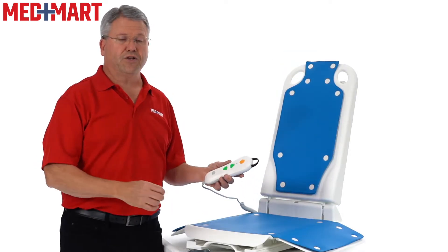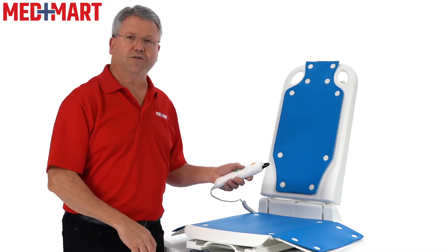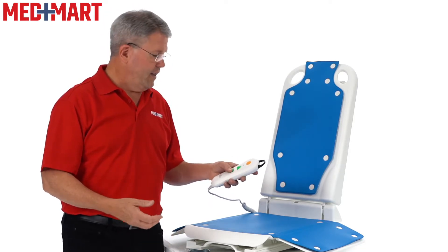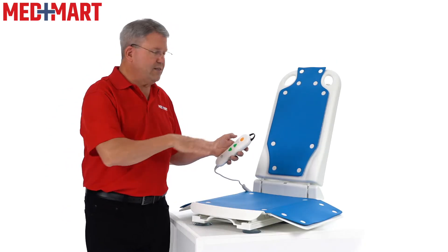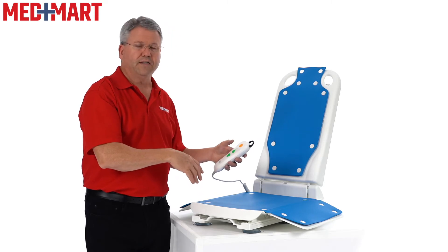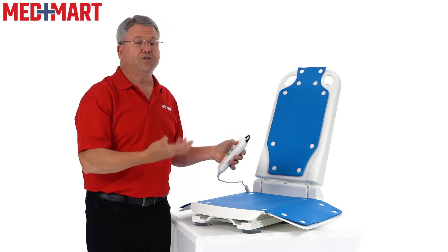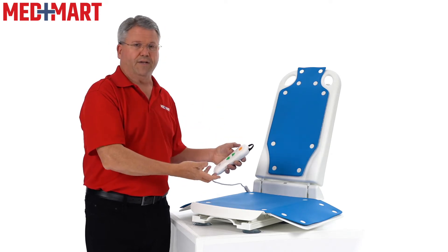The easy to use hand control features up and down buttons and has a little texture to it so that if you have any sort of visual impairment, it's really easy to use. It also features an emergency stop. If the lift stops and doesn't go in the off position as you're lowering it down, there is an emergency stop button. If you hit that, you have to raise it all the way back up to reset it before it will go back down again — that's just a backup.